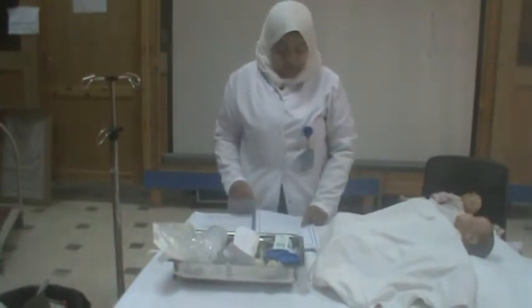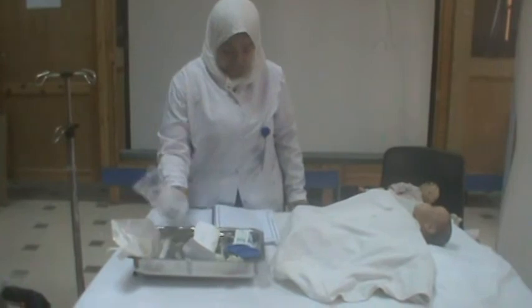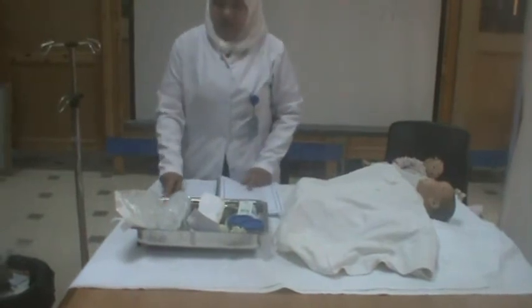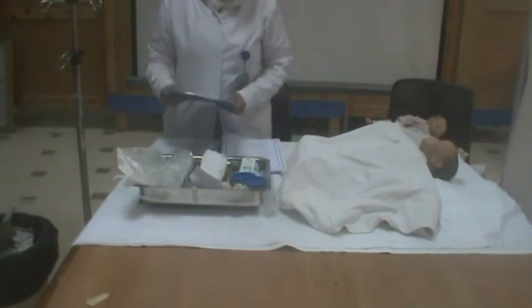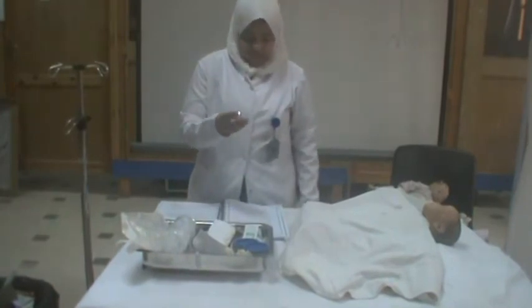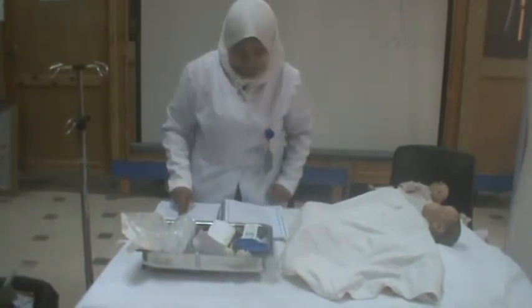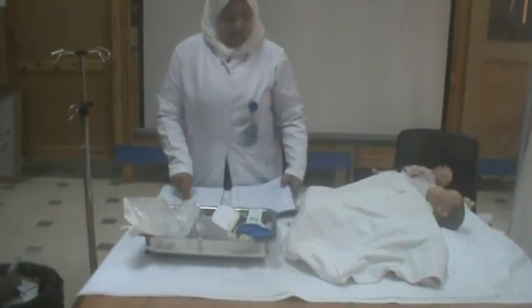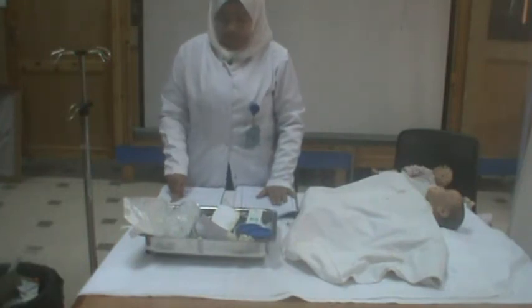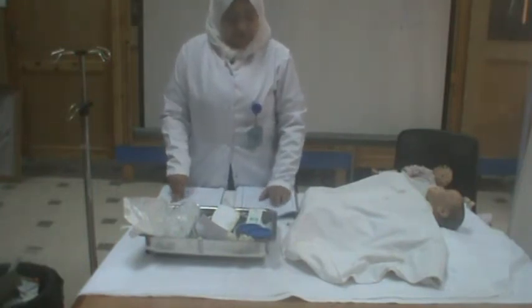Procedure — Assessment: Check the infusion fluid as prescribed by the doctor. Verify the medication sheet for child's name, room and bed number, date of prescription, type and amount of prescribed fluid, container labeled for IV therapy, expiry date of IV fluid, time of prescribing, and signature of the medical practitioner. Check the fluid for cloudiness, sediment, and discoloration.